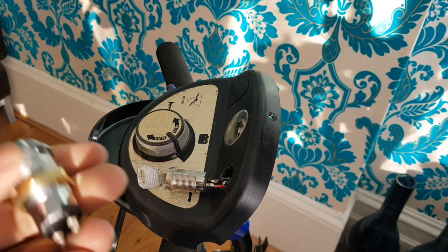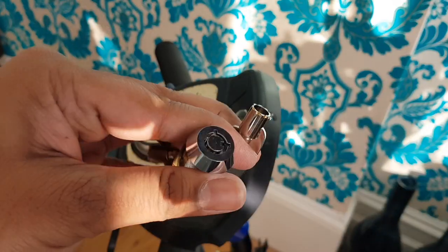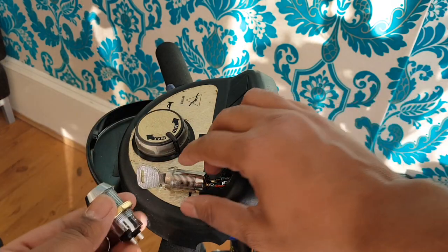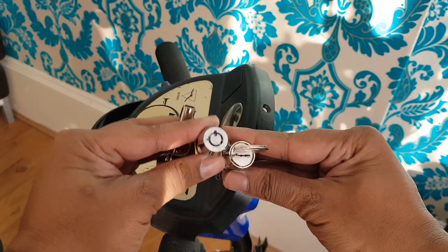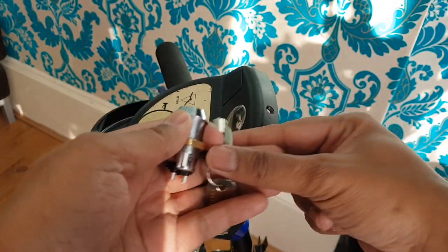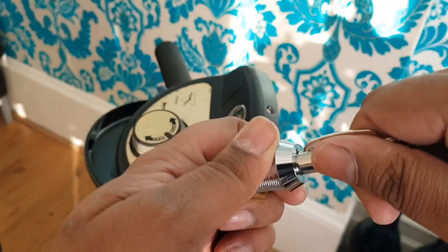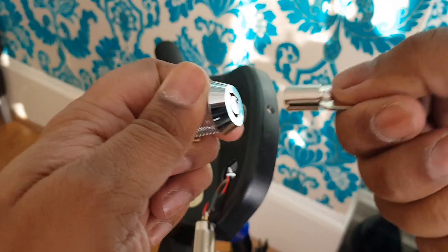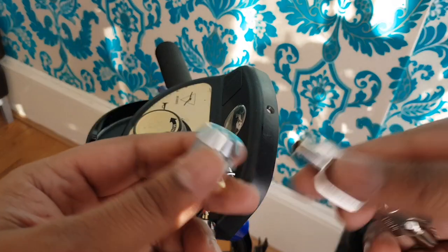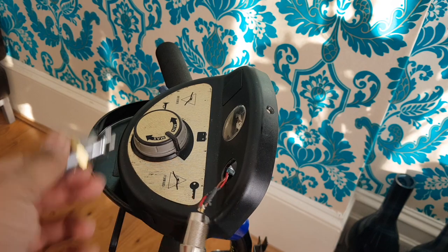All right, here we go — got a brand new one off eBay. I think it cost about three to five quid. There are loads of different ones; the barrel size just needs to kind of match. This one's slightly longer, and the one thing I don't like — which you can't tell from eBay — is that the key doesn't hold itself in position when inserted. The other one held the key in, but this one doesn't. That's all good though; we just need to unsolder the old one and solder this new one on.